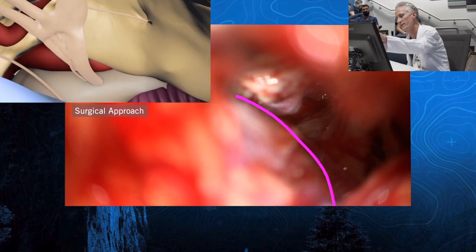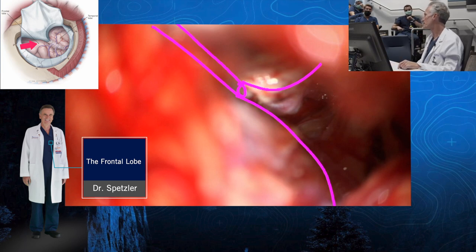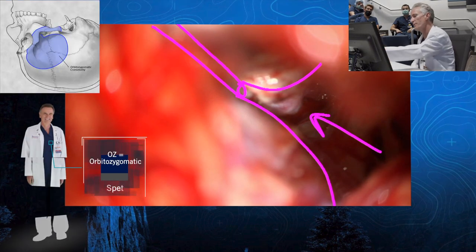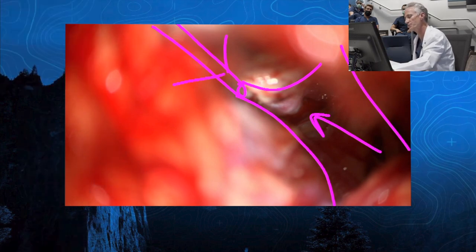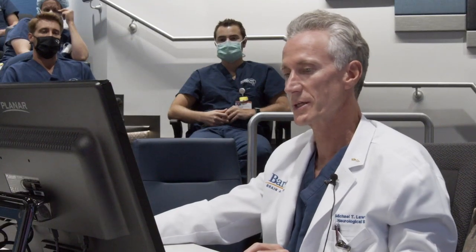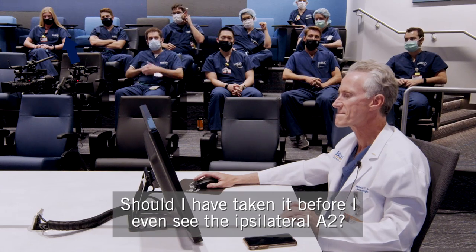If you look at what's happening here, we've got the frontal lobe and we've got our suction here doing our dynamic retraction, and it just creates this really limited view. We're trying to get up high to see this thing, and we don't have an OZ, so we've got a wall here to deal with. Just a sucker here pulling up, so it's not really that effective. It's a really high aneurysm, so it's challenging. That's why this turned into something harder than it should have been. I needed a retractor.